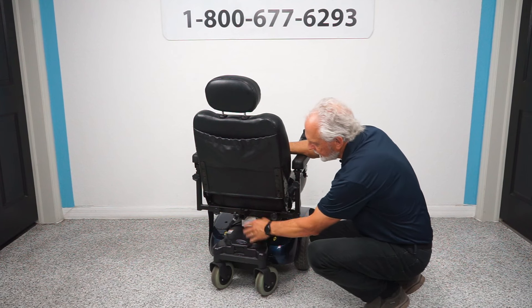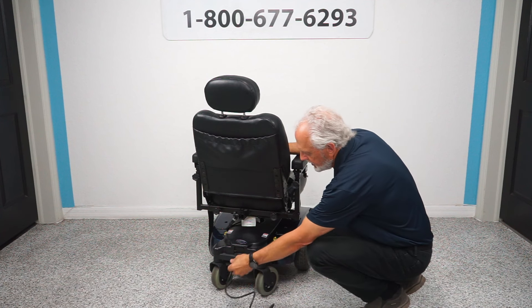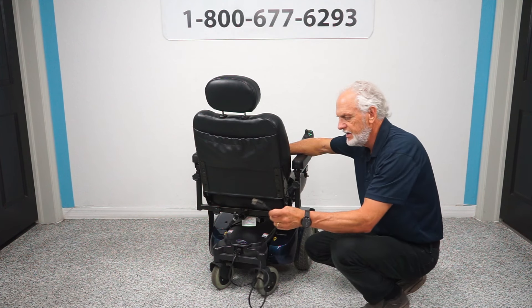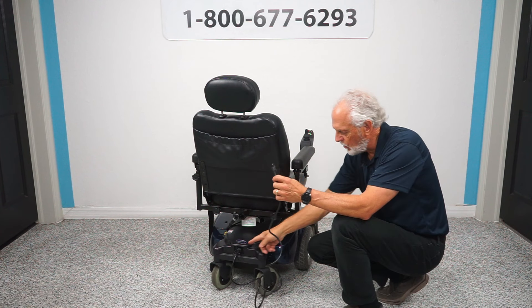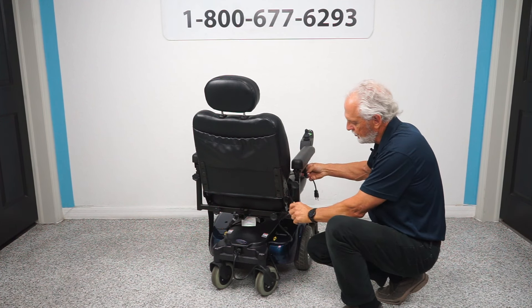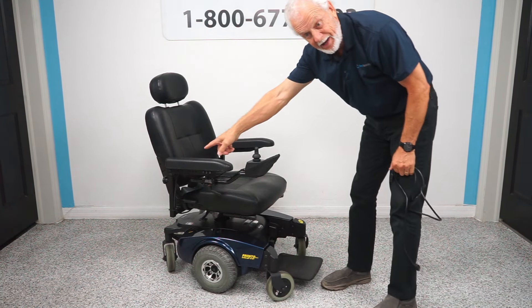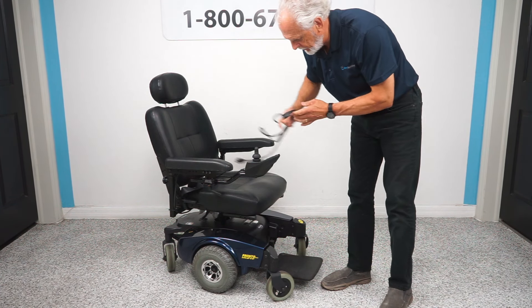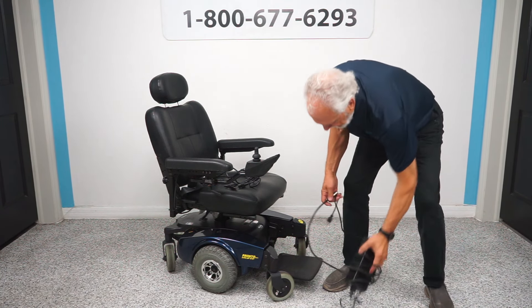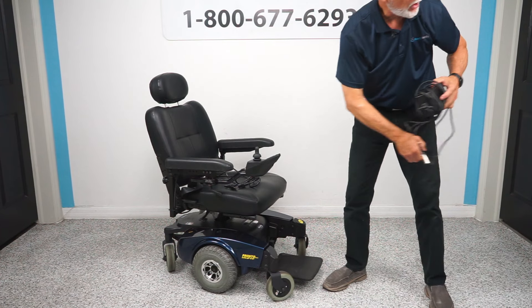This chair has a built-in charger — there's a cord right here. If you want to charge this chair, you take your cord, plug it in, open the port, and charge it that way. Some people run the cord to the side so they can just plug in at nighttime. You can also charge from the front using an external charger, so if the rear charger ever goes out, you don't have to replace it — just plug into the front and the batteries will charge.